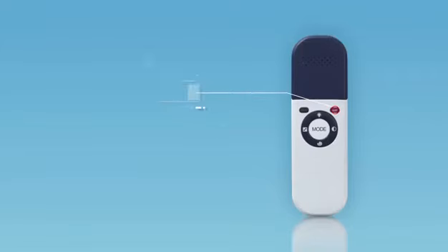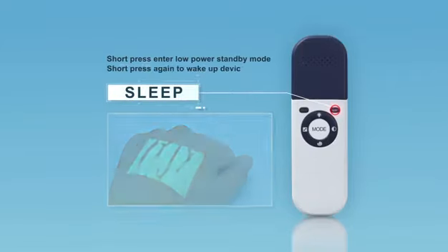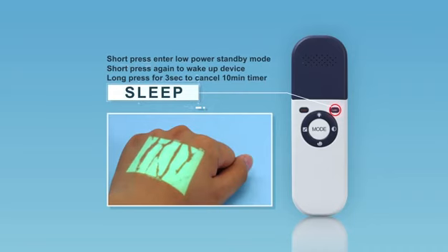Short press sleep button to enter low power standby mode. Short press again to wake up device. The default setting is that device enters standby mode automatically if no operation for 10 minutes. Long press sleep button for 3 seconds to cancel timer function, which will be shown when the timer character in top left of projected image disappears.